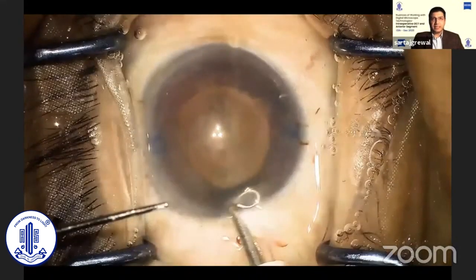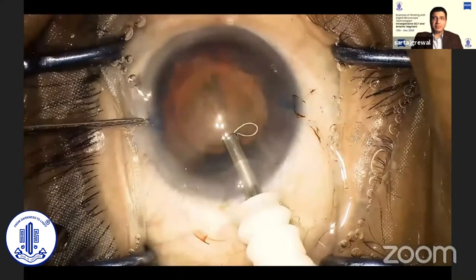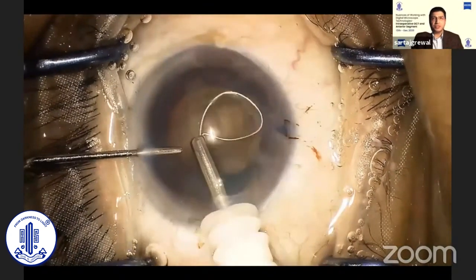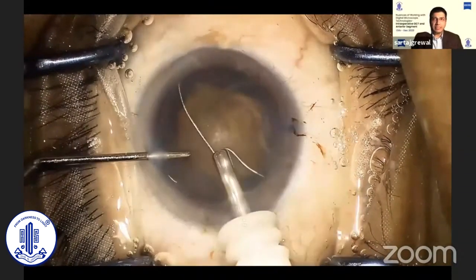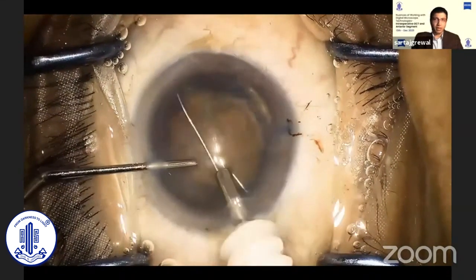With the refreshed design, the black mark has been removed. Instead, you can keep the rubber sleeve flush with the wound edge, which reduces the chances of pushing the instrument too far in and eliminates the need to repeatedly visualize and reconfirm the position of the instrument and the mark.